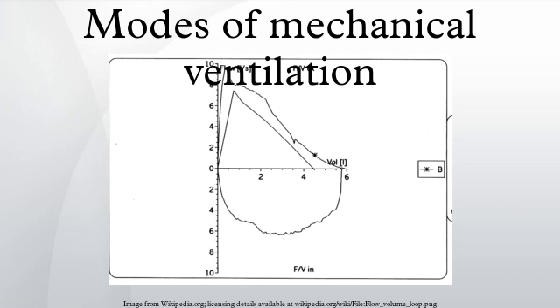Continuous mandatory ventilation used to also be called volume control or assist control volume control, though this is no longer recommended. Since nomenclature of mechanical ventilation is only recently standardized, there are many different names that historically were used to reference CMV but now reference assist control. Names such as volume control ventilation and volume cycled ventilation in modern usage refer to the assist control mode.